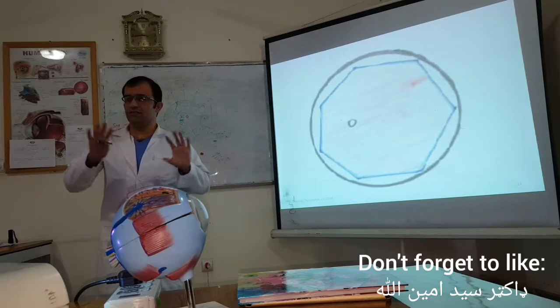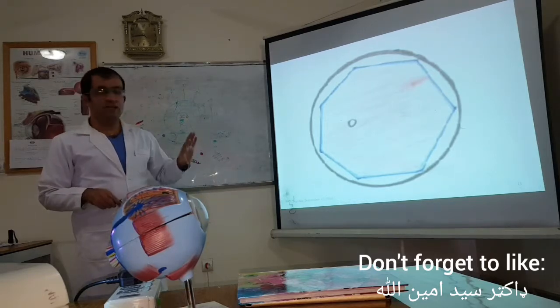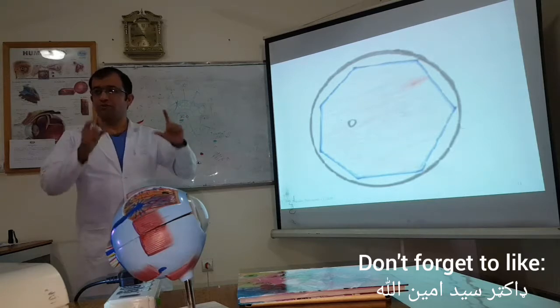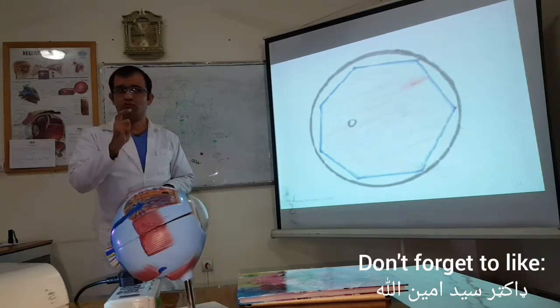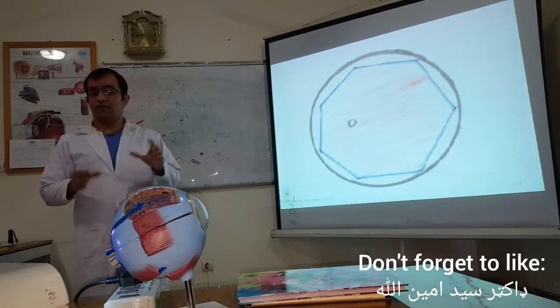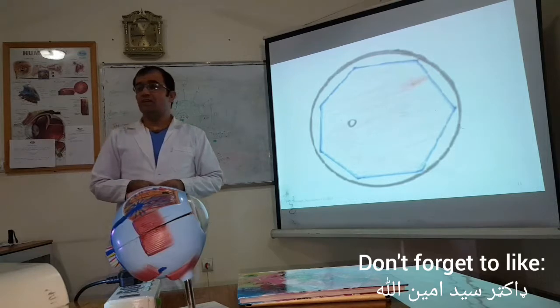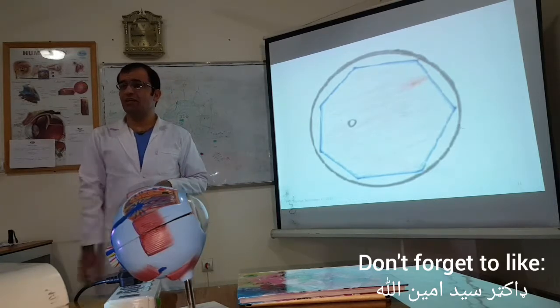If we miss some, if you don't draw, then it is not our problem because the pupil was not dilated or we didn't have enough time. We did the fundoscopy in the slit lamp. We didn't see ora serrata. But if we write the complete drawing and the lesion is there and we don't write it, it is something we missed.